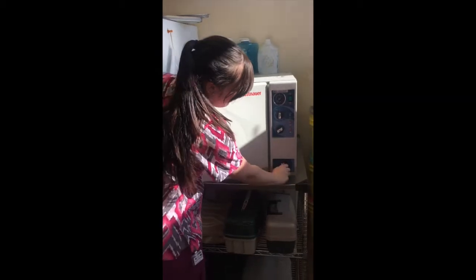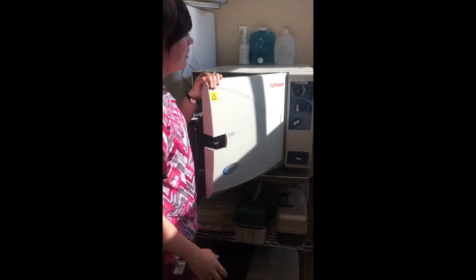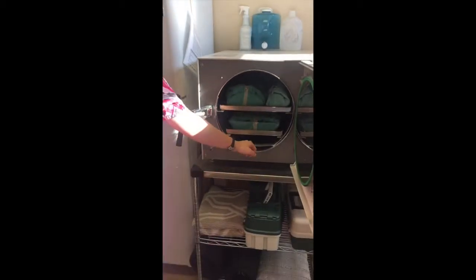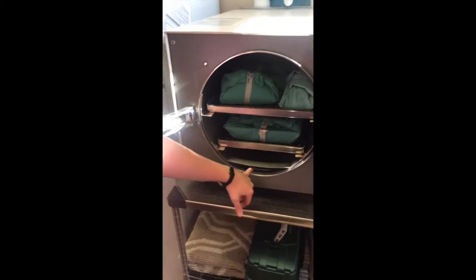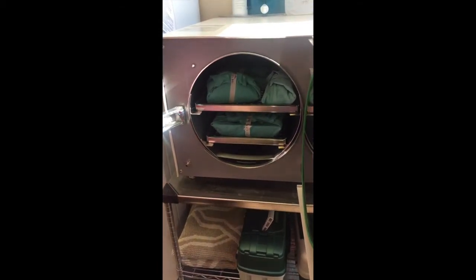The next step is we're going to fill it with water. So I'm going to turn it to fill with water, and I'm going to wait till the water gets all the way to this edge in the front. That's going to make sure that we have the appropriate amount of water for the autoclaving process. So it can take a little bit of time. So I'll go ahead and describe what's happening inside the autoclave.